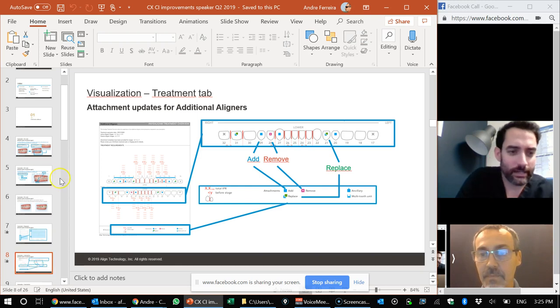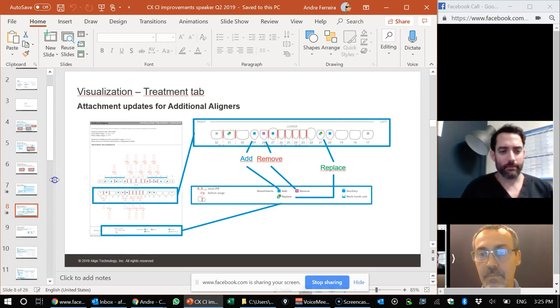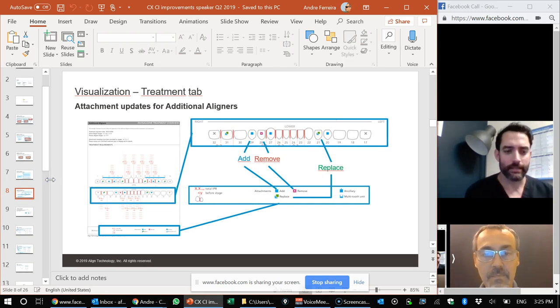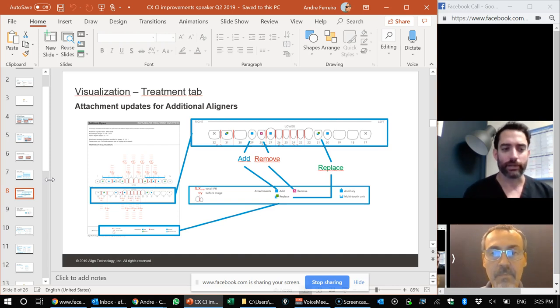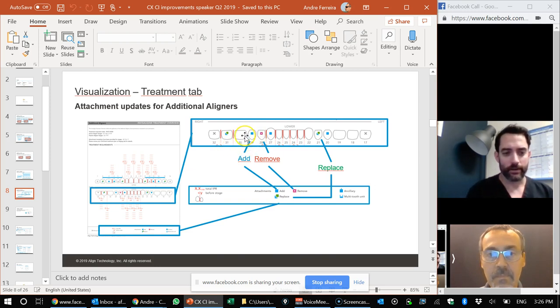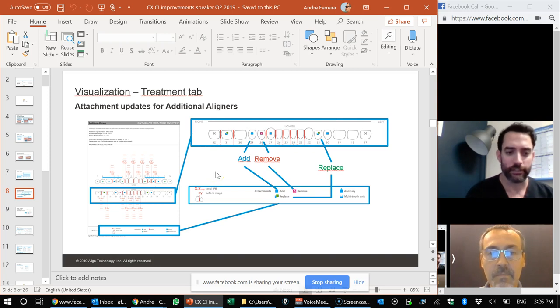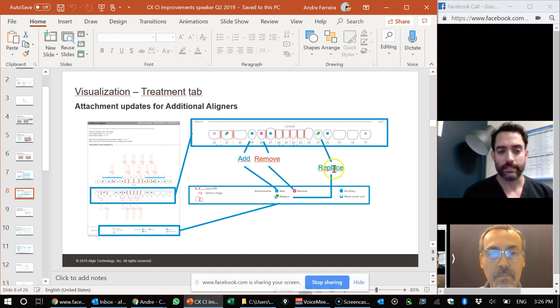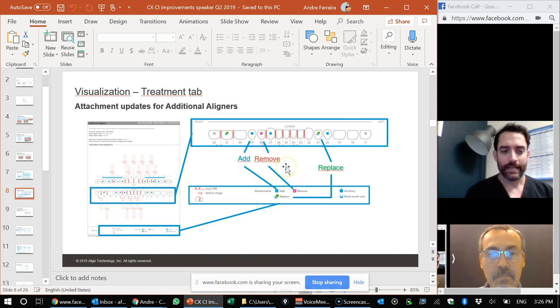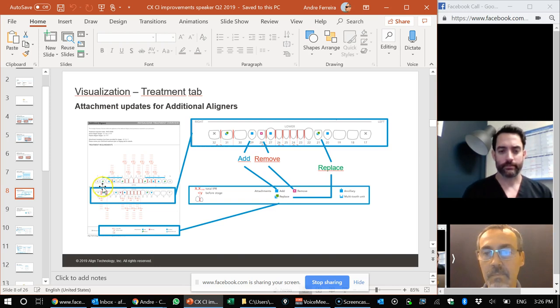This slide here is really straightforward. This is just looking at your visualization, your staging tab. It will show which teeth attachments need to come off prior to the beginning of the refinement. So now you have a red arrow right at the beginning of the staging tab. So under the treatment tab on your ClinCheck, you can see a very simple diagram that is similar to like a practice management software diagram. It is also printed and in the cases. But you can very easily see where IPR is, where attachments are, whether or not they added the feature, a green button now for attachments to replace. So you got to remove first and then we put a new one on and it's just another visual aid to help our teams not mess up this refinement step.